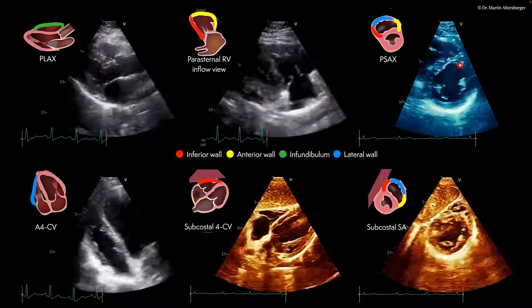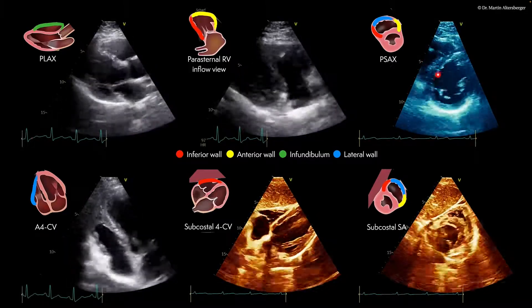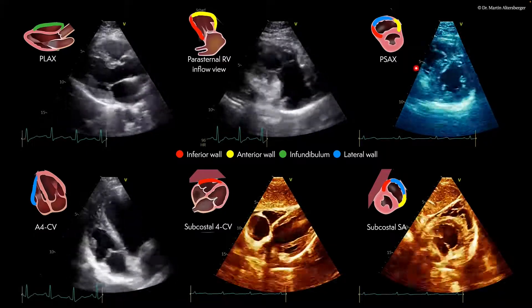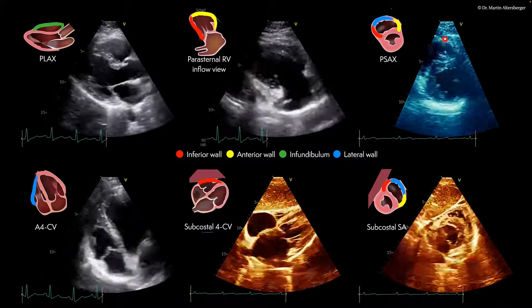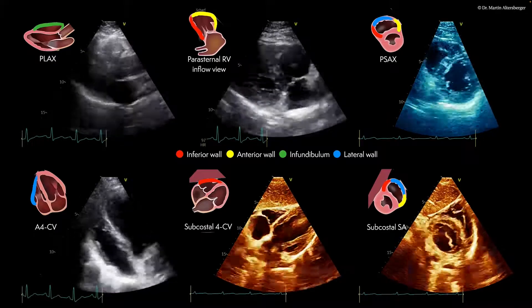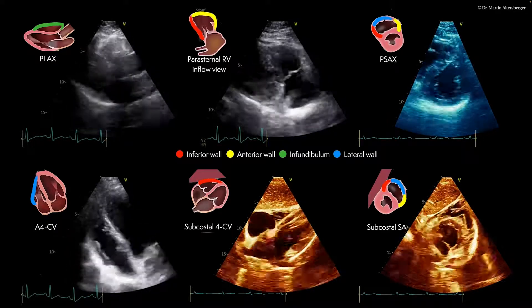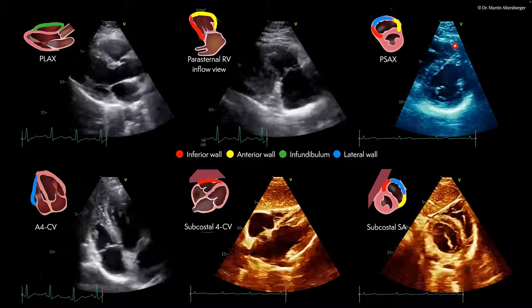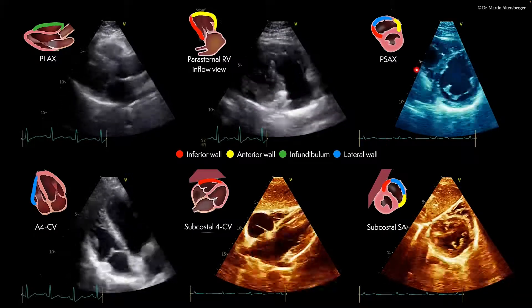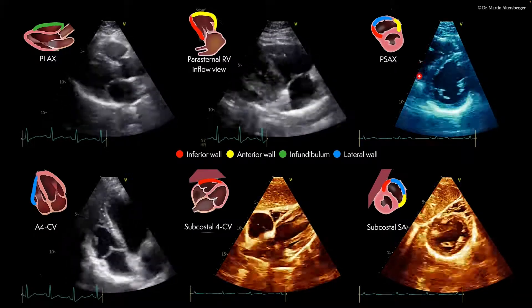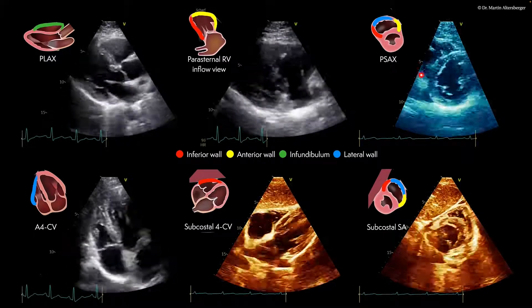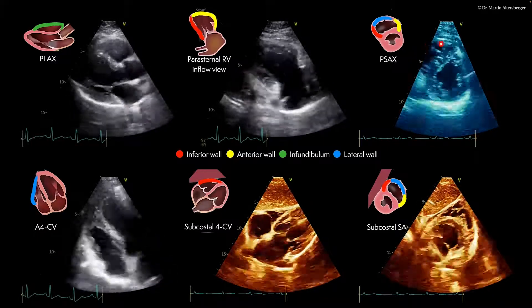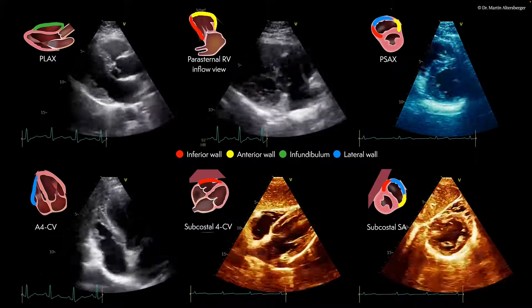Moving on to a parasternal short axis view, we have here the left ventricle in the center of the image, and around the left ventricle is also the right ventricle. Here we have even more walls to visualize: we have the anterior wall over here, the inferior wall over here, and parts of the free lateral wall of the right ventricle.